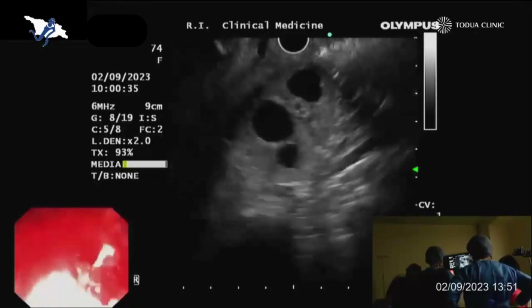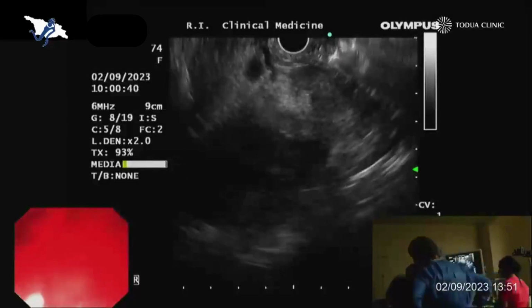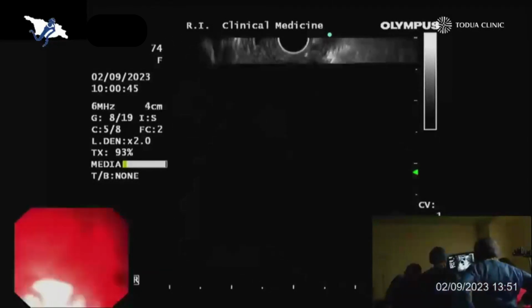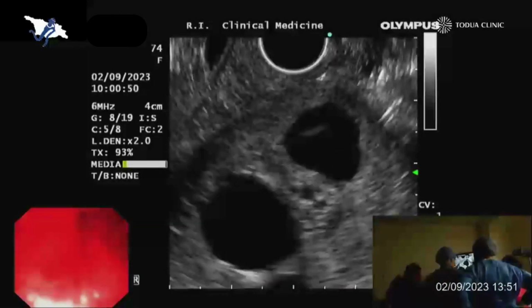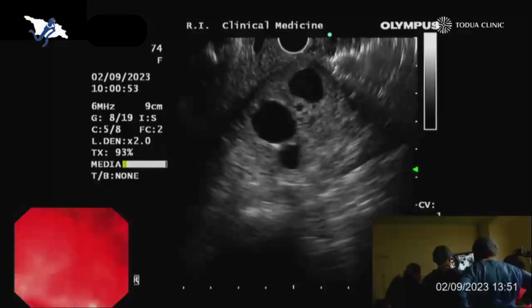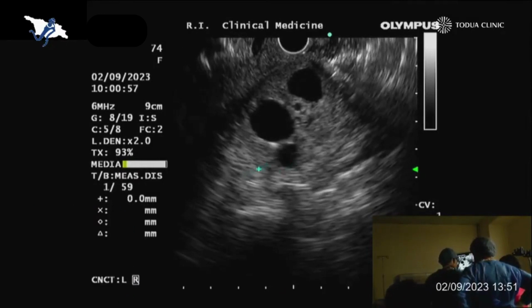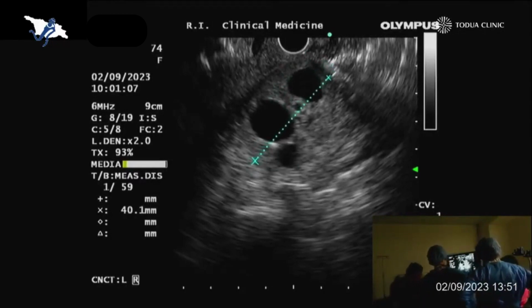This was here. Yes, right now. Okay, freeze. And decrease? Okay. One smaller, yes. Okay. Freeze, freeze. So it is somehow here, this area. Here. It's about 4 centimeters. Okay.